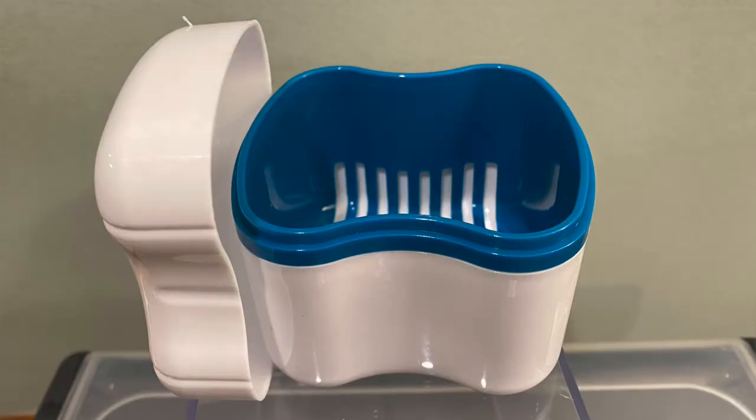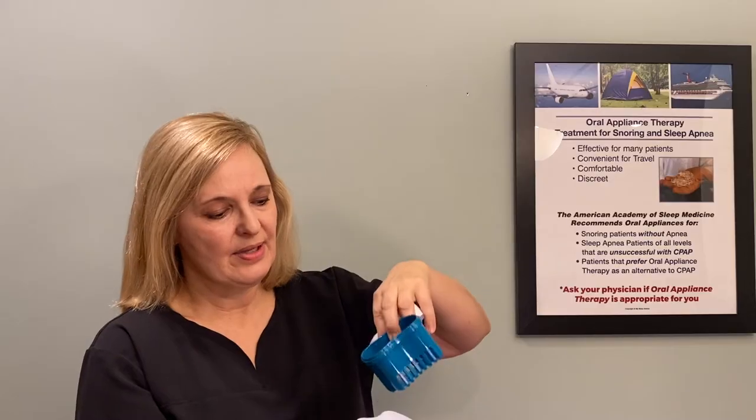This is another container — also a two-piece with a very similar structure but without a handle. It has a basket you can take out to clean. The device definitely fits in there. You can take it out to air dry really well, then put it back in for cleaning or storage.